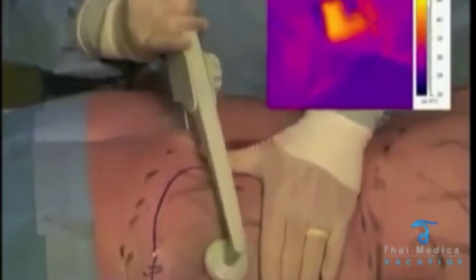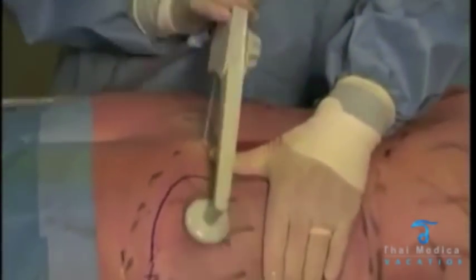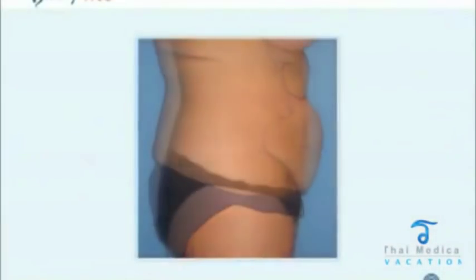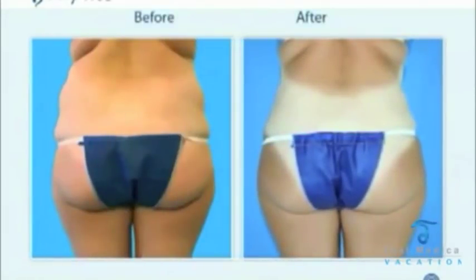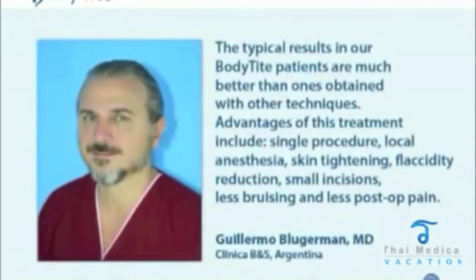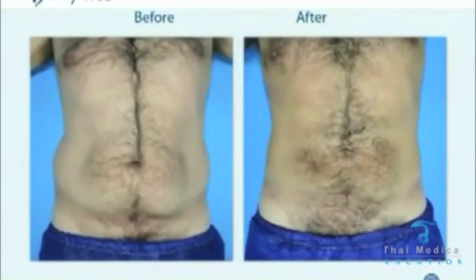The epidermal temperature never goes above 40 degrees — very safe technology and very effective. I'm now going for contour as I'm doing this, as well as coagulation and suction, staying at 60 degrees.